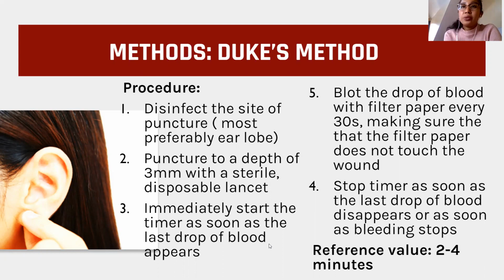Blot the drop of blood with filter paper every 30 seconds, making sure that the filter paper does not touch the wound. So please do not touch the wound when you are doing bleeding time so that you will not disrupt the formation of the platelet plug. Stop the timer as soon as the last drop of blood disappears, as soon as the bleeding stops.